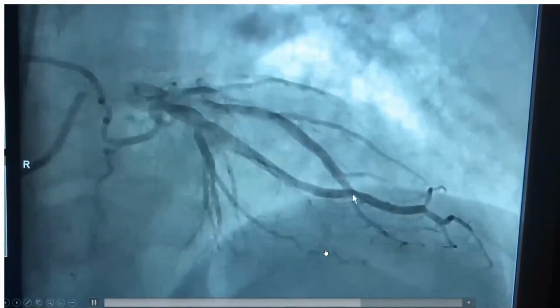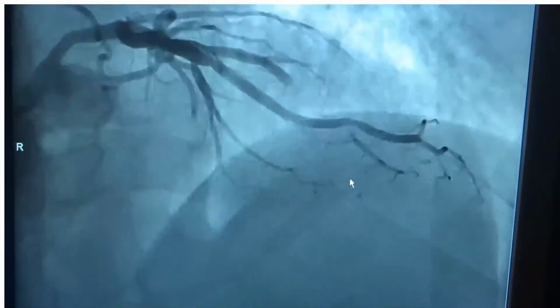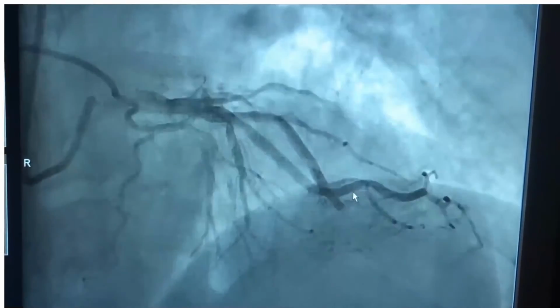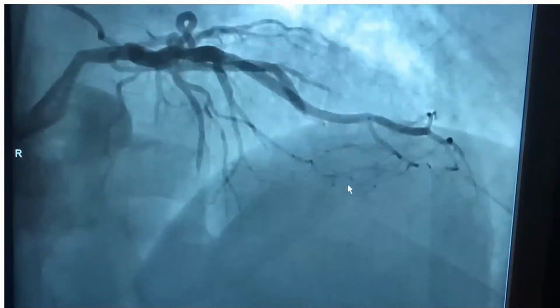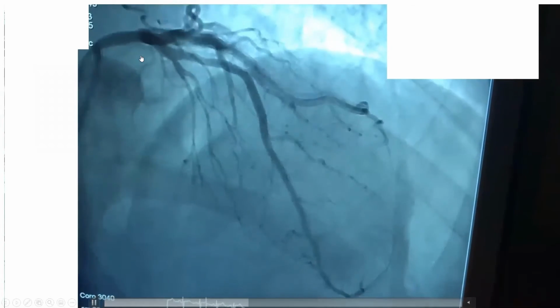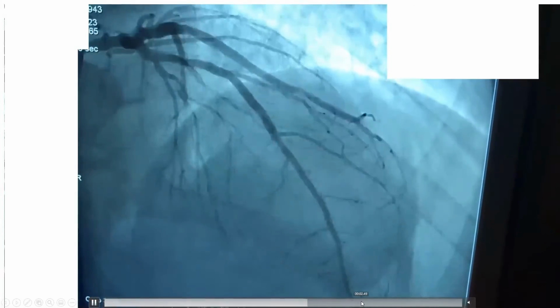Another thing that contrast does, as I explained in a prior talk, is that it is a microvascular dilator. So it will open up the microcirculation. You push the bubbles, you break them down, then the microcirculation is more open and it will absorb those bubbles. Okay? So this is what was done in this case. And within 2 minutes, on repeat angiogram, look at that. This is just with O2 and with pushing the bubble with contrast.